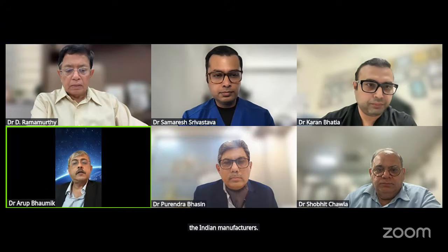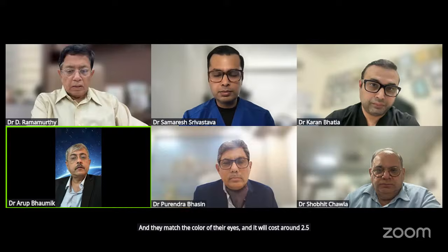There is one company that makes it, called Human Optics. They make it customized and it's prohibitively expensive, and they take about 6 to 8 weeks to custom make it. Once I inquired about the cost. They want the picture of the other eye, and they match the color of the iris, and it will cost around 2.5 lakhs for an artificial iris.